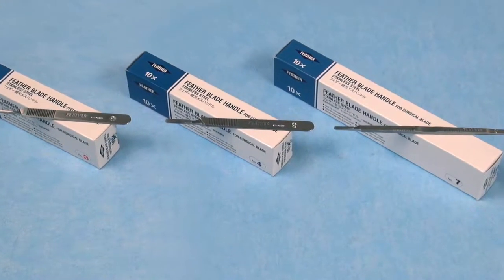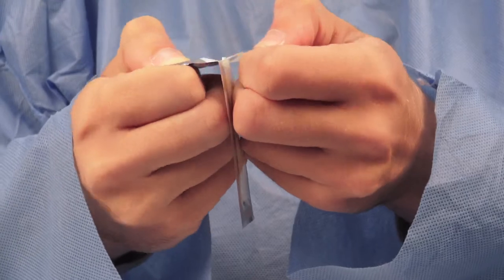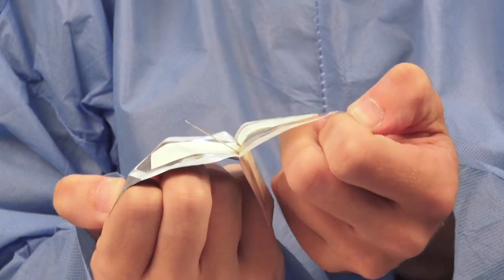Feather stainless steel handles are designed for functional handling ease and perfect balance. We offer three handle options, individually packaged and sold, to accommodate our nine different blades.